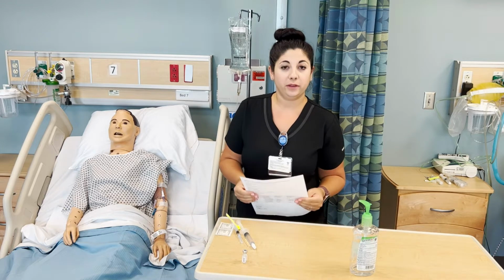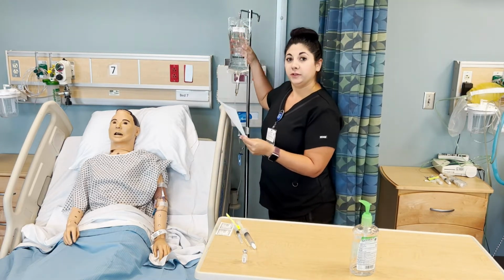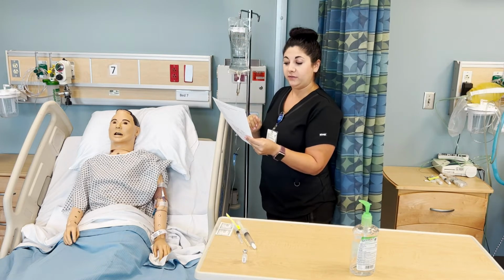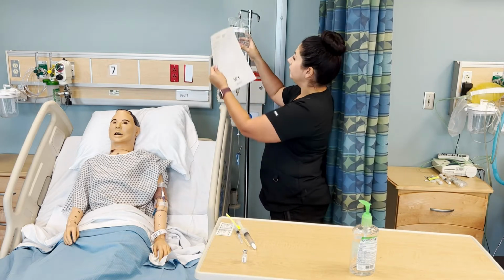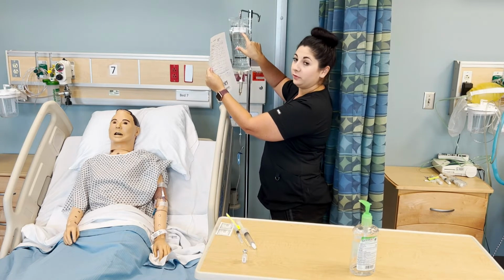Then I will do my third check of the medication. I need to make sure that the fluids I have running are the fluids that I have on my MAR. So I will compare my MAR, the name of the fluids, against the name of the fluids on the bag.